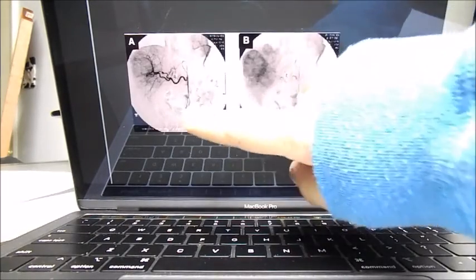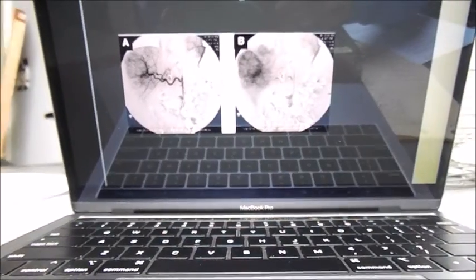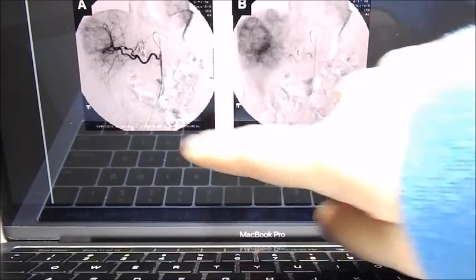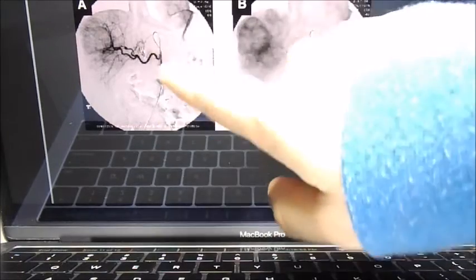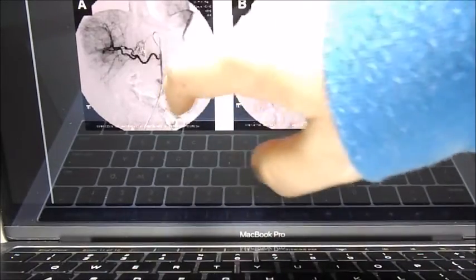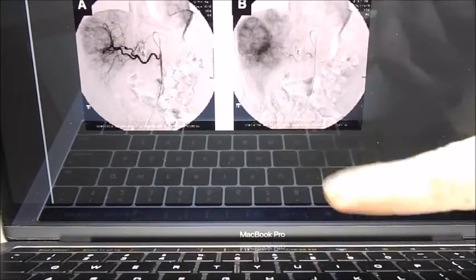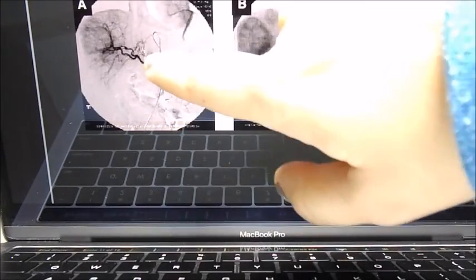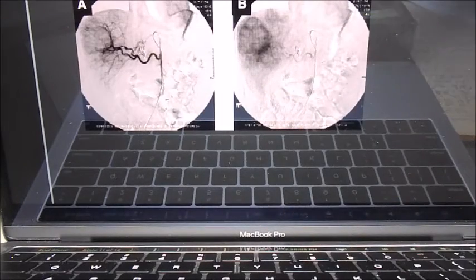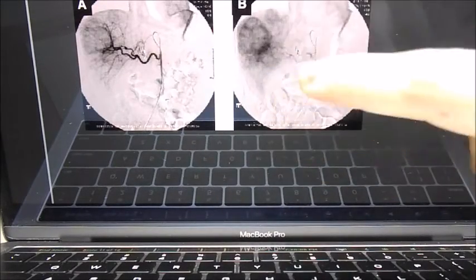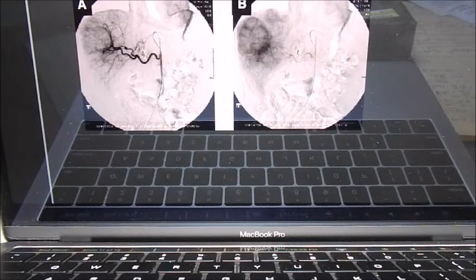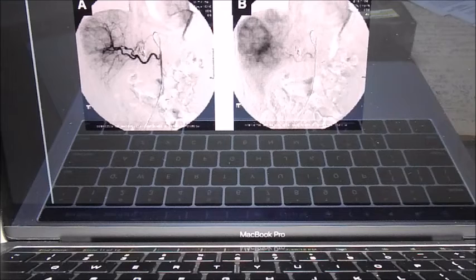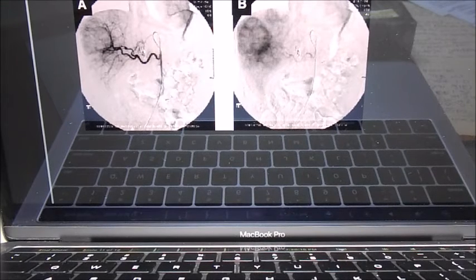So this is kind of a good image of what we did. We were up into the area and then we would squirt the contrast so you would kind of just see a flurry of it with the beads. We made sure we stayed in the right spot and then it was going right with the contrast that was mixed with the bead block. After they were all injected, we could see it was a faint outline of where the beads and contrast were.